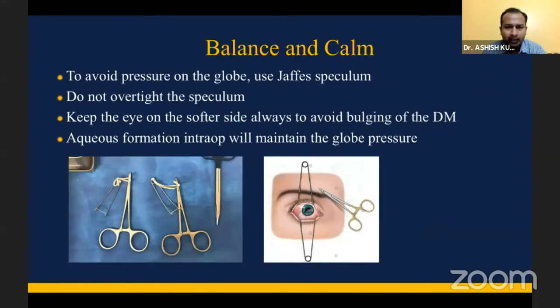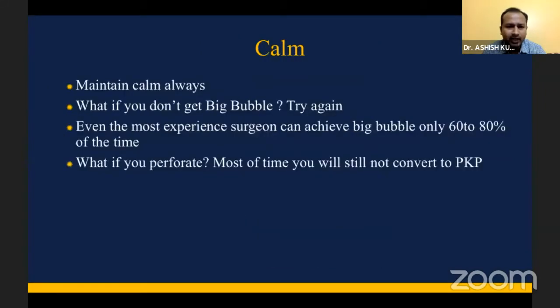Again, maintain balance and calm. With balance, what I mean is do not over-pressurize the globe, because you're trying to expose the DM here. So instead of using a regular Castroviejo speculum, it's better to use Jaffe's here. And always make sure that the globe is on the softer side to avoid bulging of the DM. Aqueous formation intraop will take care of the globe pressure. So always keep draining fluid from the side port. And don't worry that the eye may become very soft, because aqueous formation will continue throughout the procedure. And maintain calm.